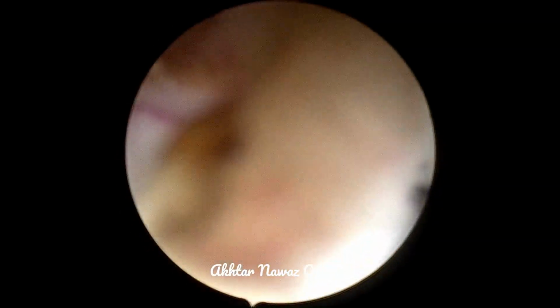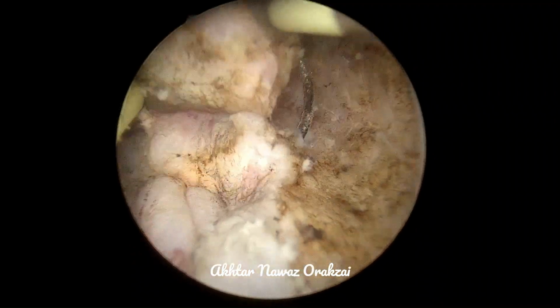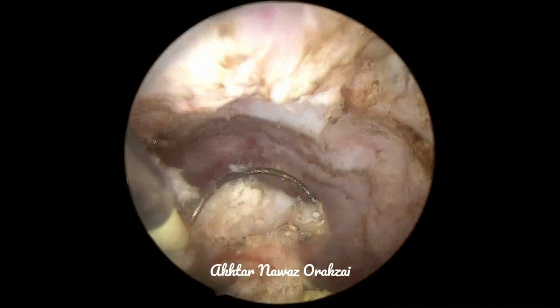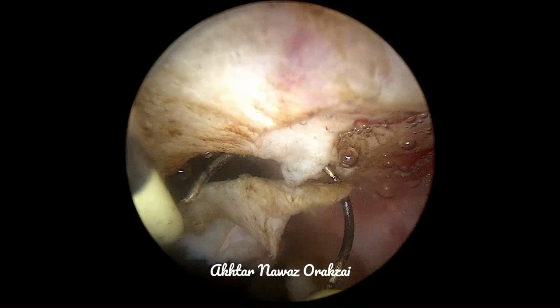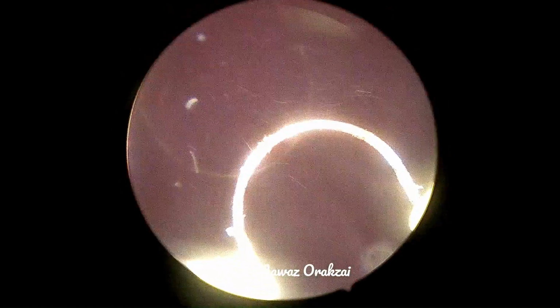So the anterior and posterior lobes need to be resected carefully, keeping in view the anatomy of the capsule. So fine tuning is remaining here, and the rest of the procedure is complete. In a while we'll start coagulating the prostatic cavity.